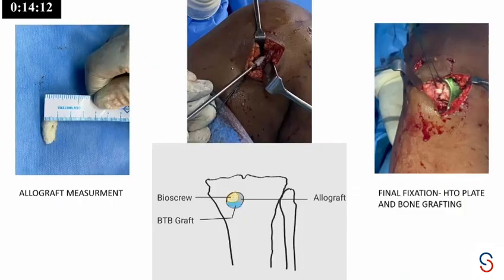Chirag, what are your screw sizes? Because they are very critical. What size screws? 10 mm screw. So I had an 11 mm tunnel on the femoral side. It was 11.9. So my graft was 11 mm there on the femoral side. I used a 7 mm screw for the femoral side. 7 mm on the femur? Yeah. Okay, it's a tough bone. And the tibia? Tibial side, it's a 10 mm screw that I've used here. And it's a biocomposite screw?